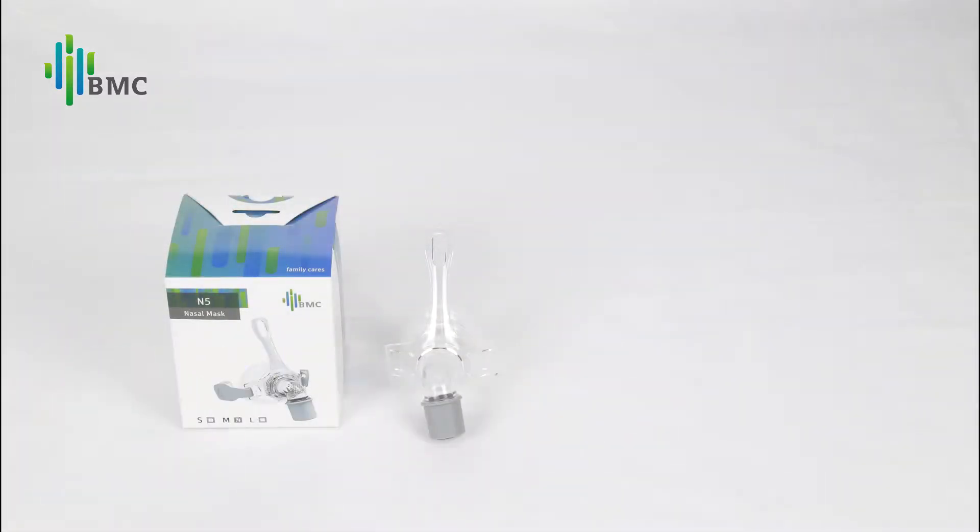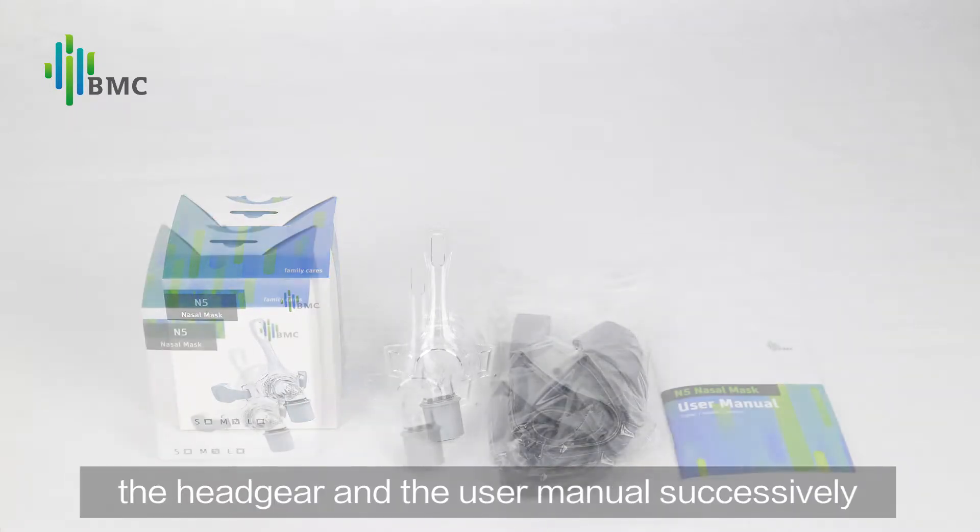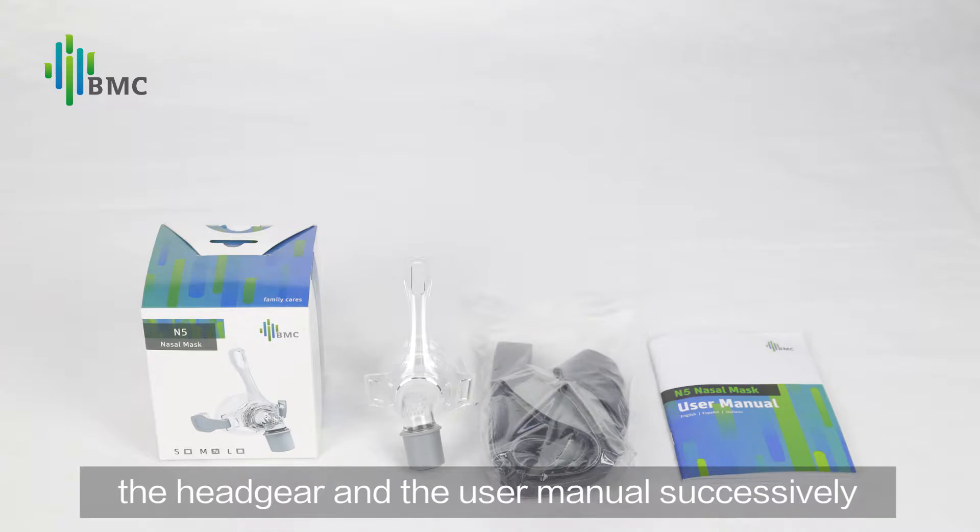Preparing the mask: Open the package. Take out the mask, the headgear, and the user manual successively.